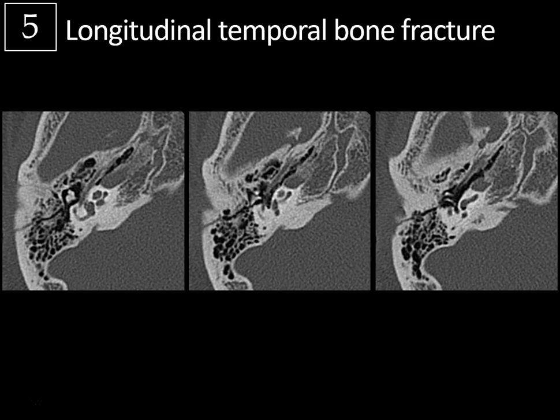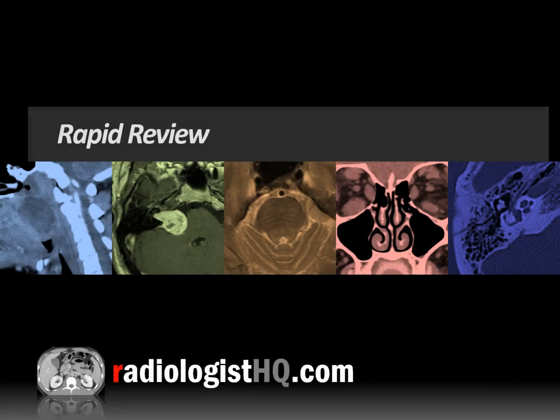A few other structures to evaluate: the facial nerve canal is here — this is the horizontal or tympanic segment — and you want to look for any facial nerve disruption with a temporal bone fracture. The carotid canal is right here, which is definitely an issue if the fracture extends into that region. Also note the otic capsule — the dense bone overlying the cochlea — and describe whether the fracture involves that capsule or not.